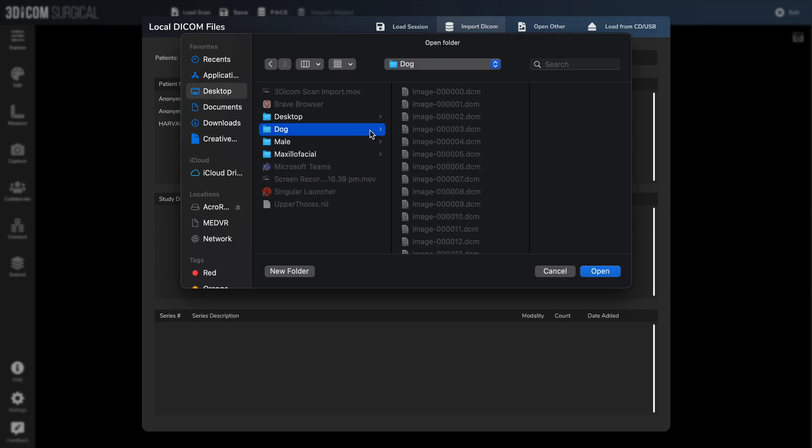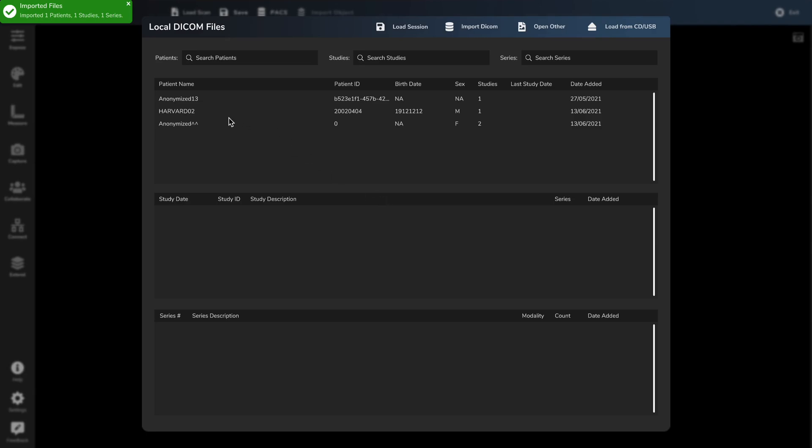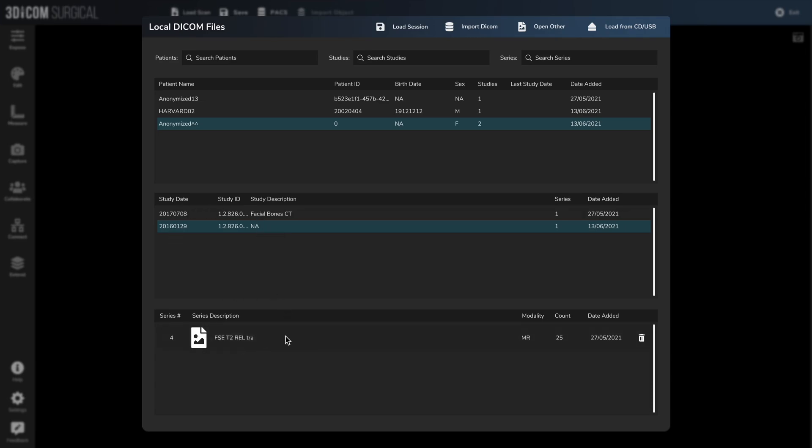DICOM scans are not just limited to humans, so we can select a scan of a dog. This will import it in and it becomes part of this anonymized scan here, and we can go through. It's only 25 slices, so a very poor quality scan. Here's the studies and here are the different series.